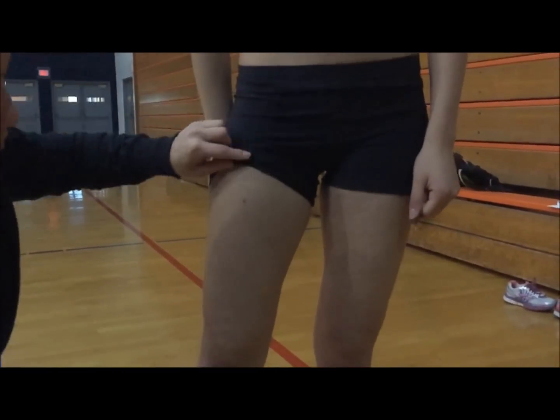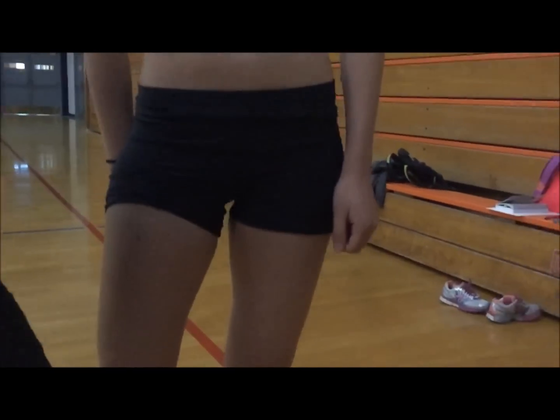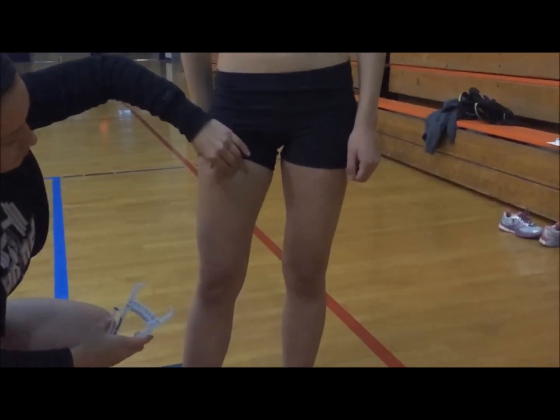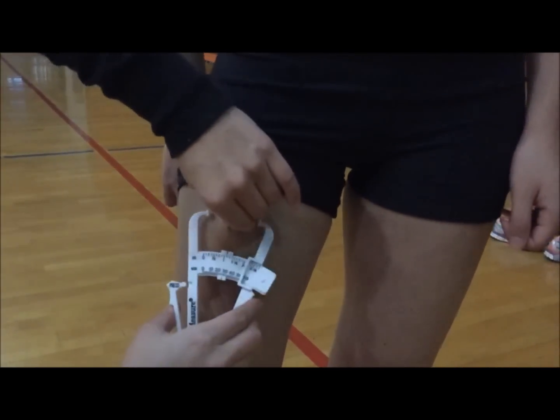Lastly, we will be doing the thigh area. Make sure that the subject has all their weight on the left side of their leg, keeping it loose to be able to take a good measurement. This will also be a vertical hold. Make sure to maintain the pinch, especially in the thigh area.